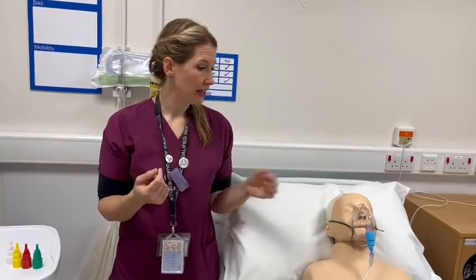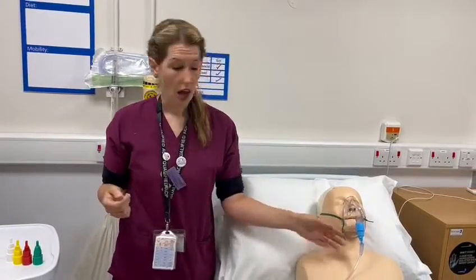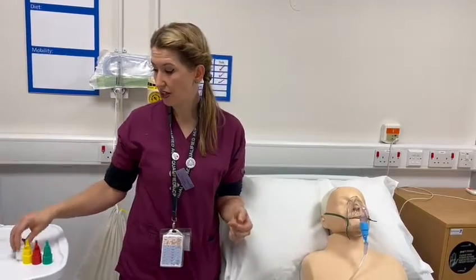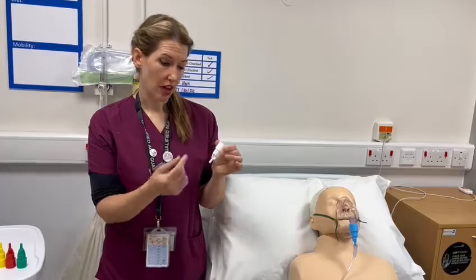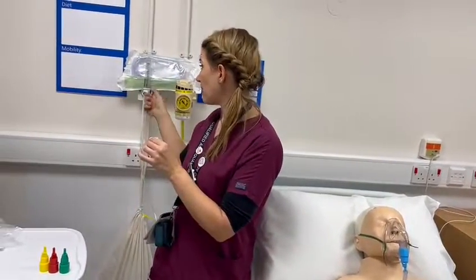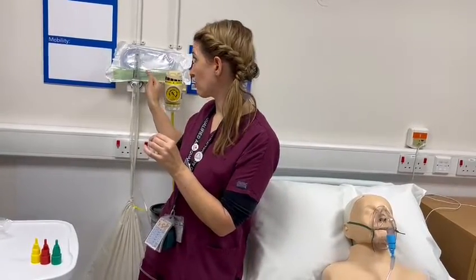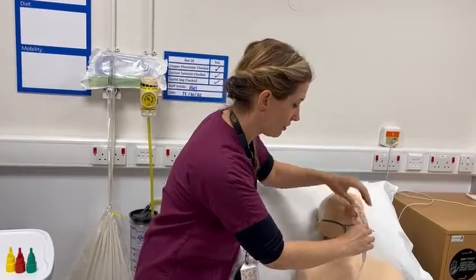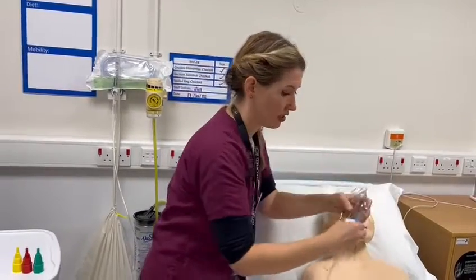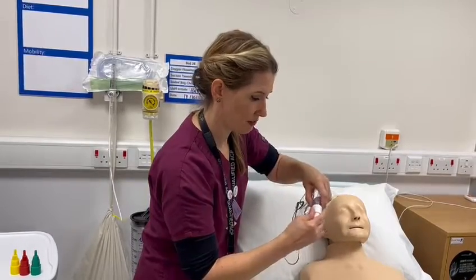If your patient wasn't responding to the Venturi at the lower percentage, then you could simply swap your devices to get them up to target range — making sure that you come up to the right amount of oxygen delivery through the oxygen port and then just change your mask. I often would just take it off, change my mask, and pop the new device on simply like that.